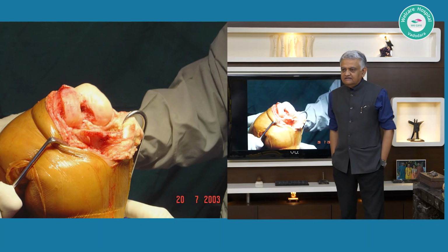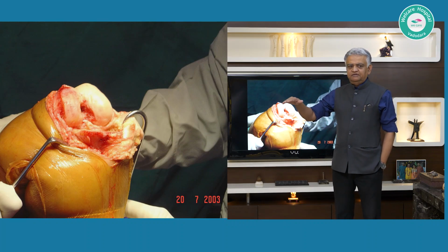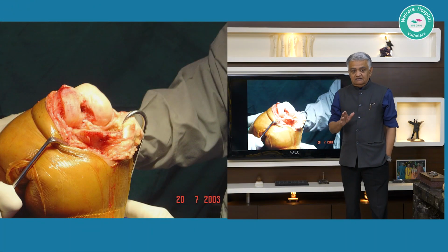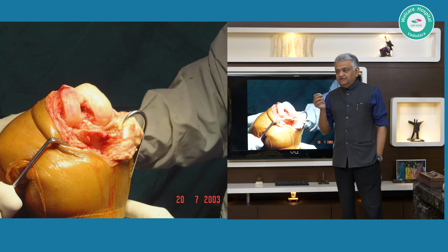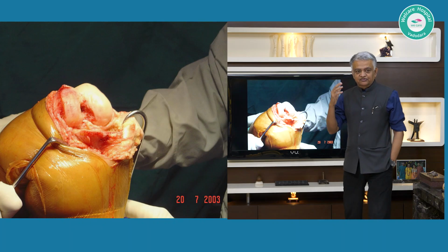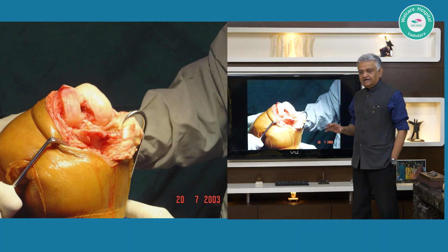We realized that although it looks to be a simple action, just chop off the top of the tibia, it took us a better part of almost 45 minutes of the last lecture to understand how many things go into making that cut as far as the surgeon's brain processing is concerned of the situation on the ground.